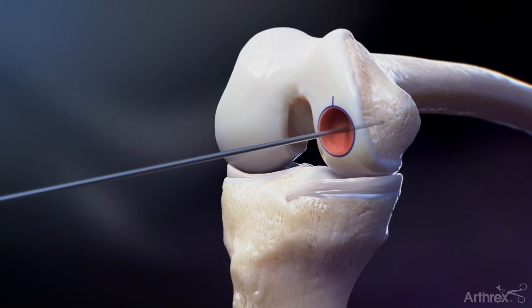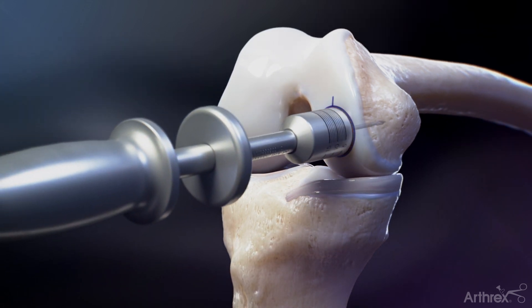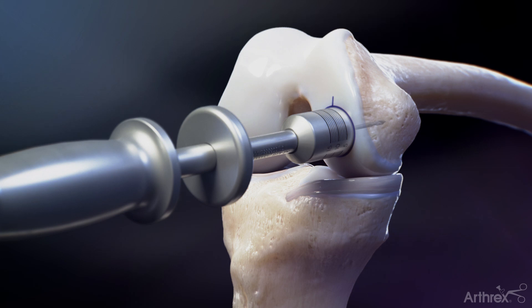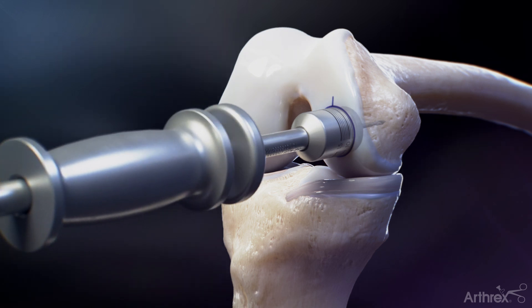Thread the appropriately sized allograft OATS dilator onto the slap hammer and insert it into the recipient socket site to achieve a 0.5 mm socket dilation. Advance the dilator until it has seated fully into the socket.